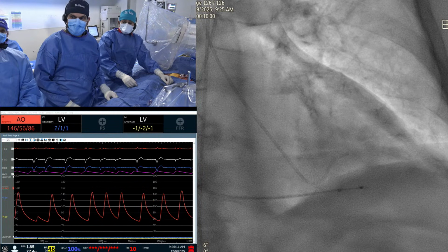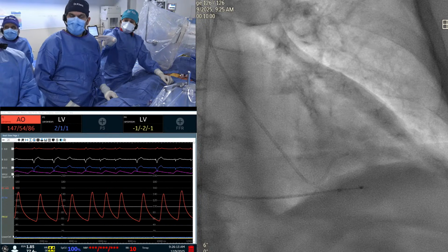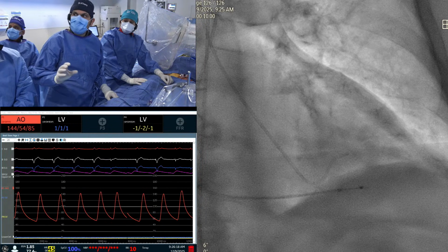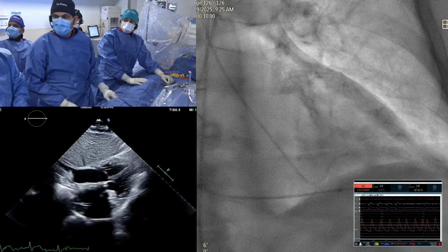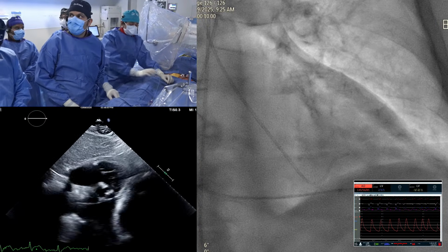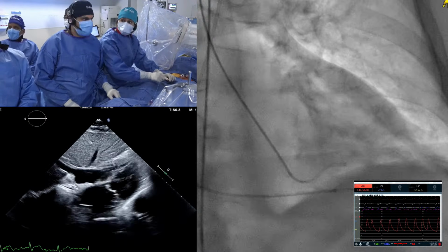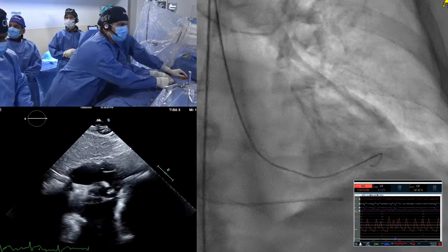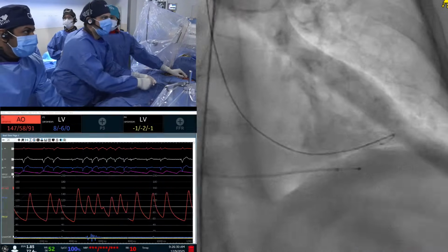Why? Yeah. So can you put the hemodynamic screen on the fluoro, picture in picture, PIP on the fluoro, and make us full screen right there, right? Great. Yeah. Can you have the operators on the full screen? Yeah, we don't need the echo right now.